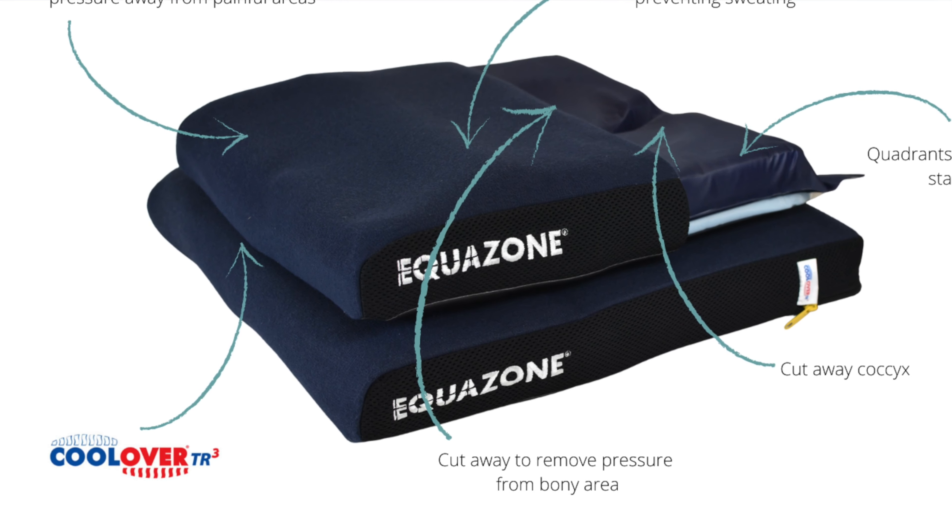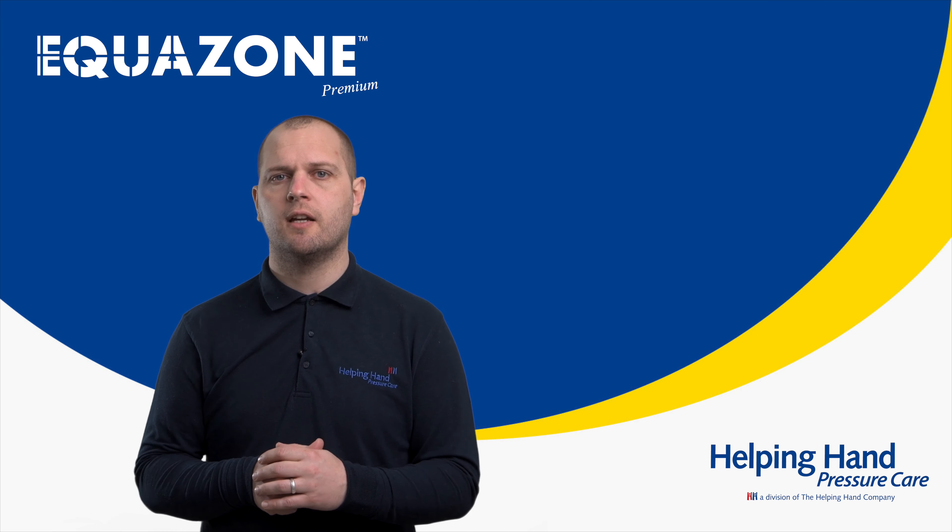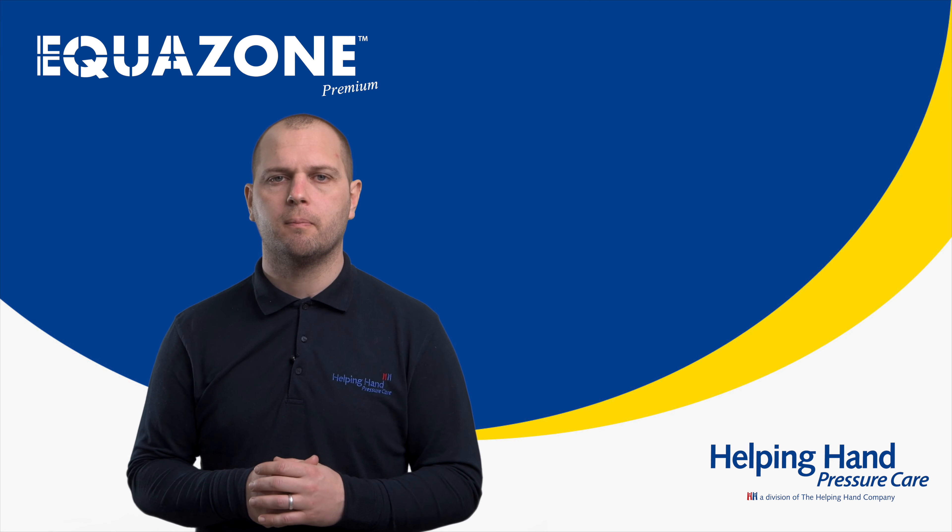The Equizone Premium comes as standard with the Cool-Over Comfort Cushion Cover. This is to promote air accessing the user's seated area, with Cool-Over fabric on the surface to regulate the user's skin temperature and minimize the chance of sweating and/or moisture build-up.